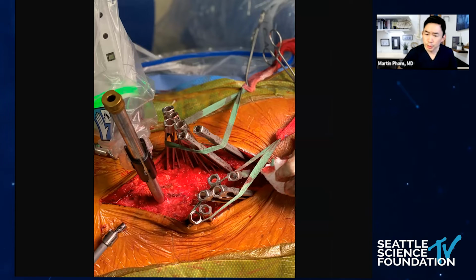So I've done this both ways. I've done the stab incisions. I've done a single skin incision. This is an example of a single skin incision. And you can really see how bloodless it is. And for someone who's 75 turning 76, I just don't want to have the stress of blood loss and fluid shifts and checking the lactic acid and the base deficit and making sure I have a good anesthesiologist so that he doesn't get behind. These screws go in and it's a nice, comfortable time in the operating room where I know he's not going to die.